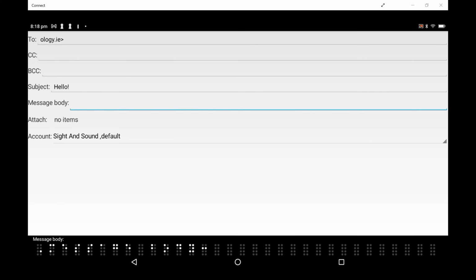And we'll just say hi, Fionnuala. Hi Fionnuala, comma, how are you today, question mark. And for those people outside of Ireland, Fionnuala is an Irish name, so of course BrailleSense struggles with pronouncing it. Hi Fionnuala, how are you today? And I did a typo on the word how, so I'm just going to fix that, and I'm going to send this message with Enter and the letter S to send.